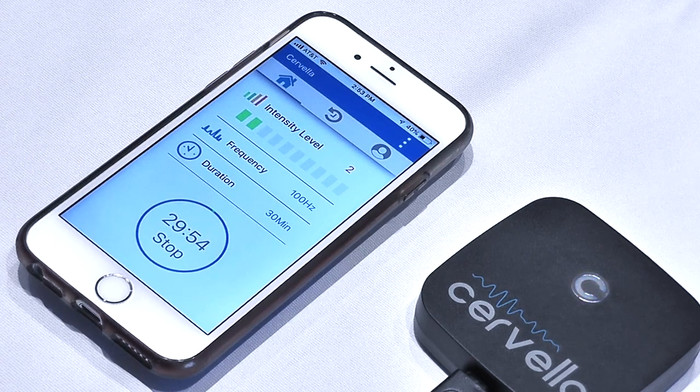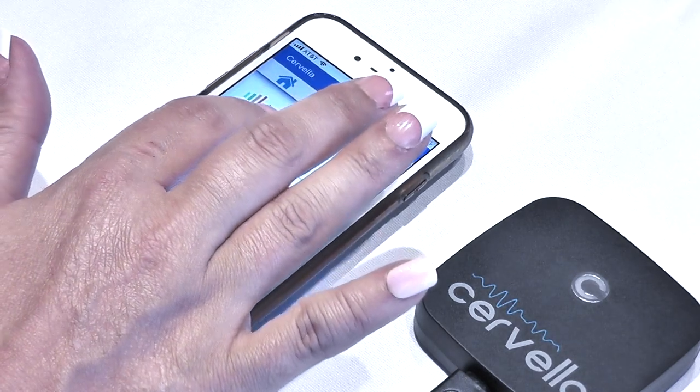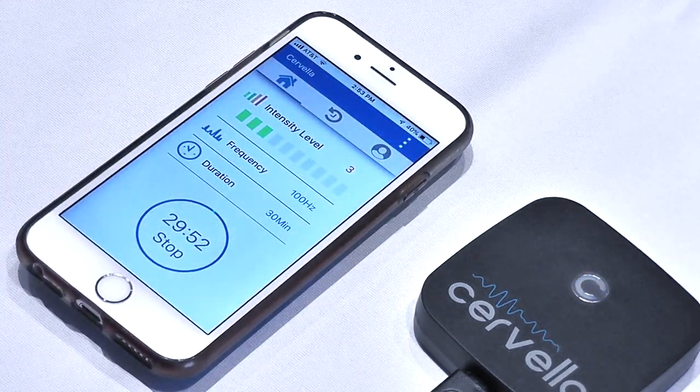If the light remains solid blue and the timer does not start, the electrodes are not making good electrical contact with your skin at the mastoid contact area.